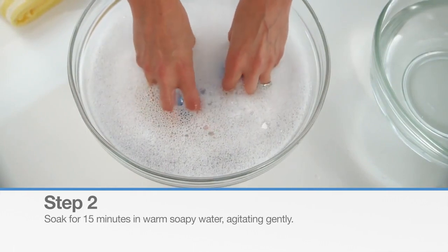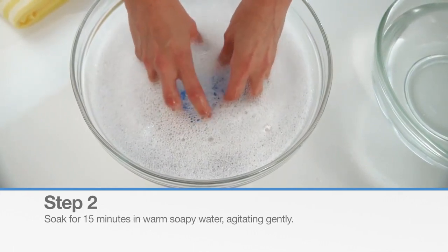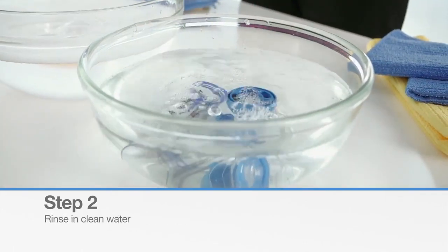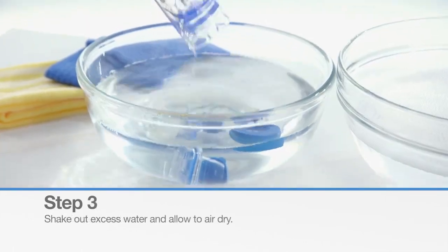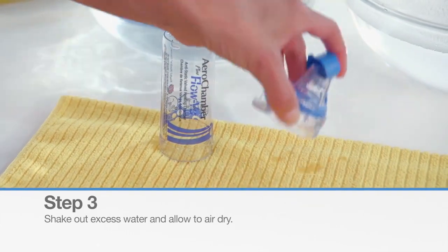Next, soak all three parts in warm soapy water for 15 minutes, agitating gently. Rinse the parts in clean water. Shake out the excess water and allow the parts to air dry completely before reassembling.